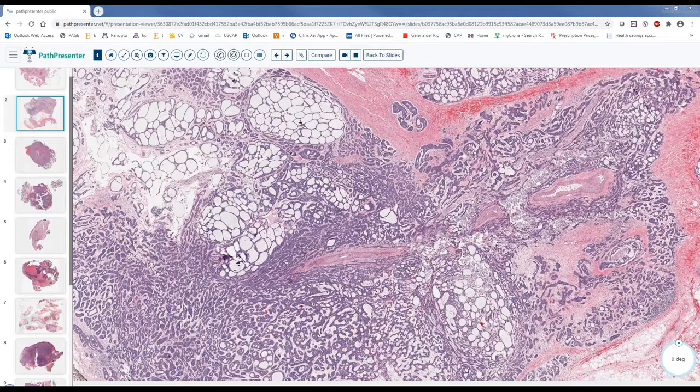The MYB immunostain, the MYB-NFIB gene fusion. If you'd like to do FISH, it is not crazy specific. You can still see that in some lesions, but it is more than 80%. I mean, it's not that crazy sensitive. It's not 100%. It is 80% of the time. So if it is negative, it could still be adenoid cystic carcinoma. If it's positive, that's mostly okay. So 80% of the time, adenoid cystic carcinoma will be positive for MYB-NFIB. Okay. So let's recap for adenoid cystic carcinoma.